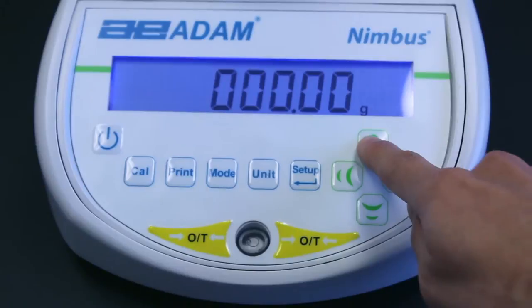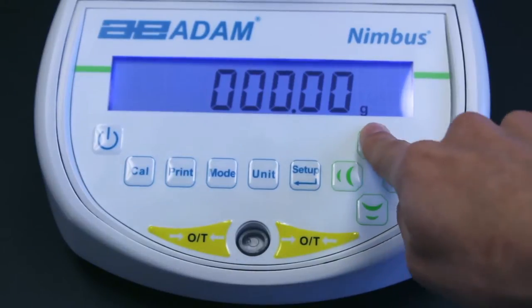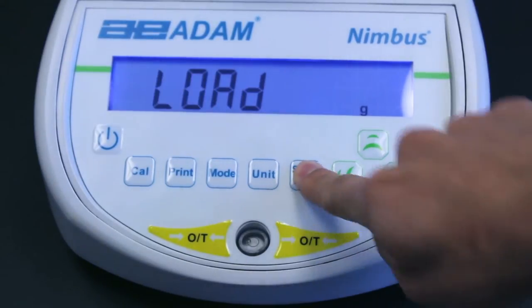If necessary, you can change this value by using the keypad. Press Setup Enter to continue.